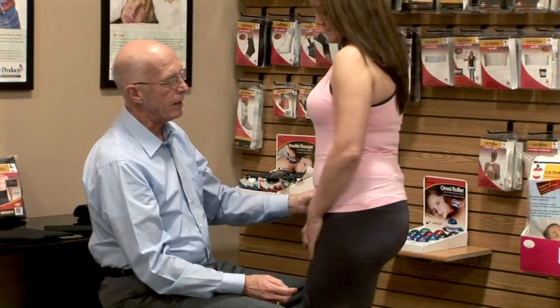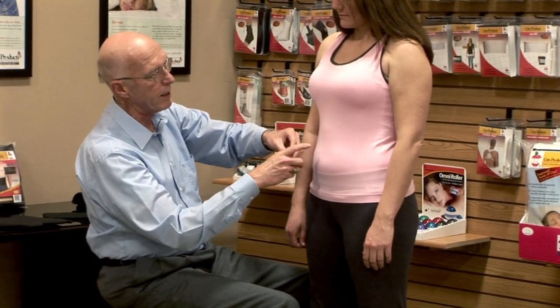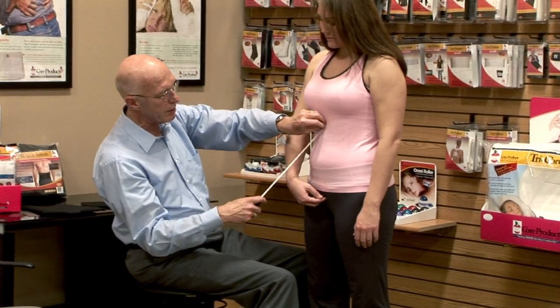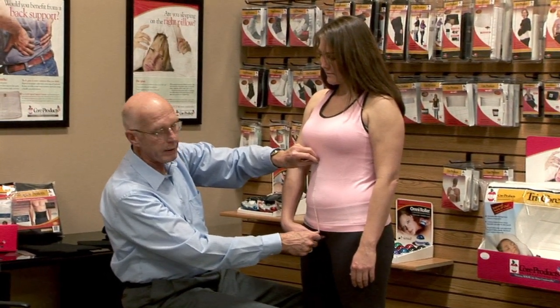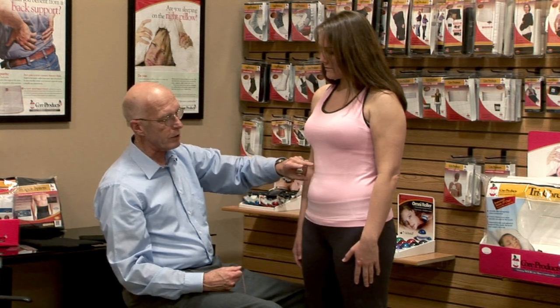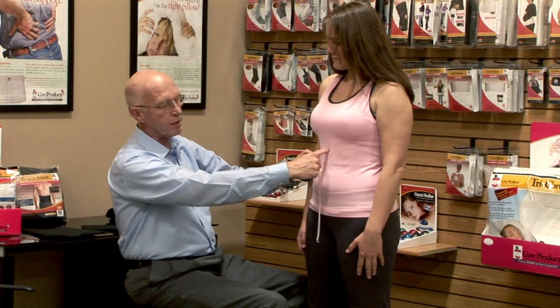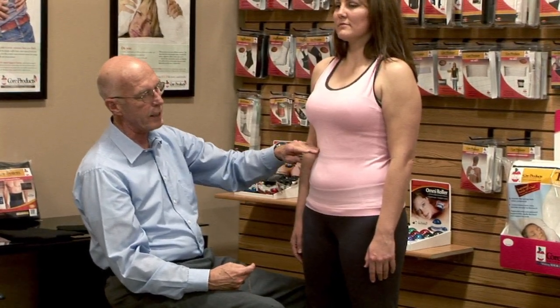That would be the maximum height of any device you want to fit, and it becomes part of your documentation. Anteriorly, you would start at the top of the flare at the xiphoid process and measure to the symphysis pubis — that bone below the belly button — to get the anterior length measurement. You'd want the device to come to about the level of the tenth rib, which is halfway between the xiphoid process and the inferior angle of the costal flare. You wouldn't want a device higher than that.